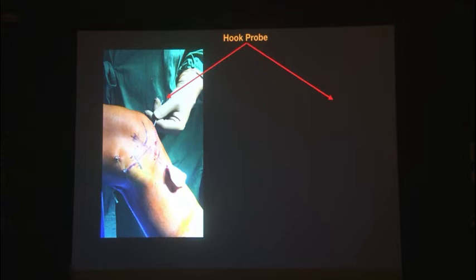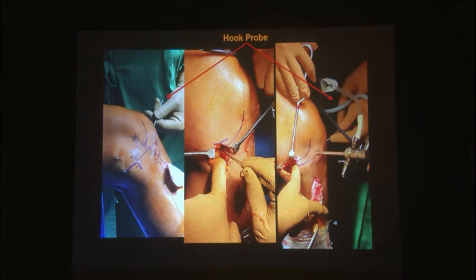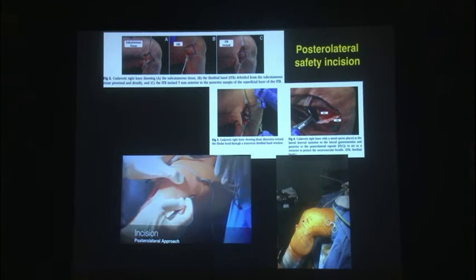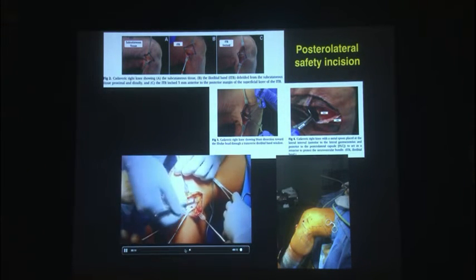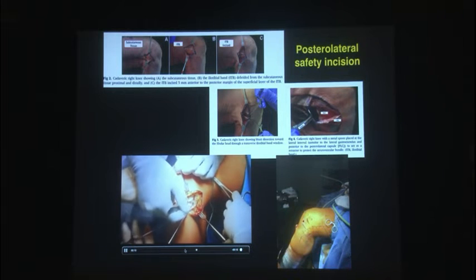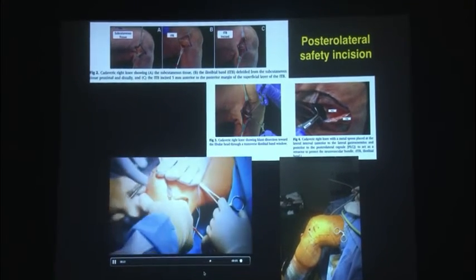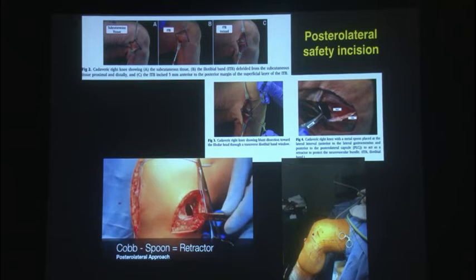The knee is flexed to 90 degrees and a posterior vertical incision is made — base the incision two-thirds below, one-third above. That gives you a lot of play to retrieve those needles. That's me incising the sartorius fascia, dissecting the capsule, and that's the simple spoon from your kitchen. On the lateral side, you take a longitudinal incision, dissect the IT band, and slightly posteriorly create a longitudinal incision in the IT band. Dissect the lateral gastroc away, then use your cob elevator to push the entire gastroc with the neurovascular bundle, and then the spoon comes in.